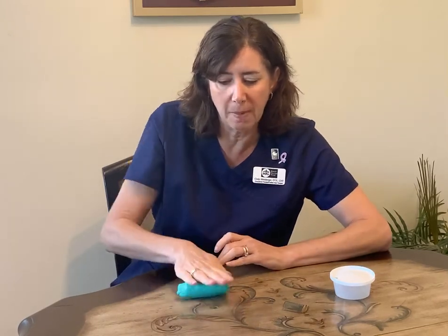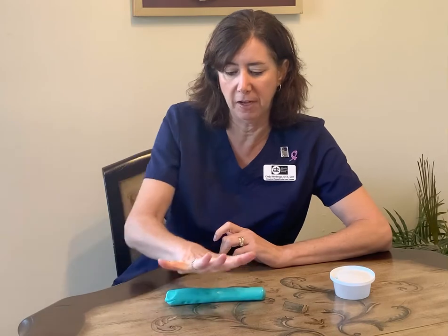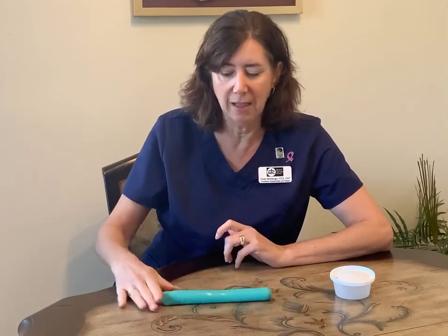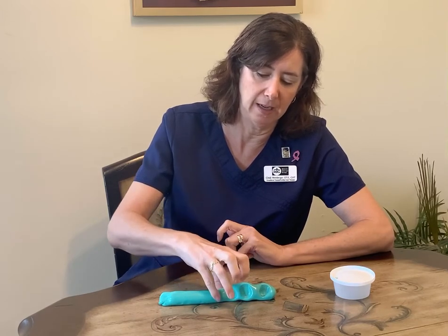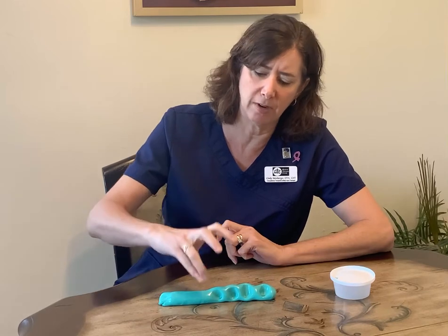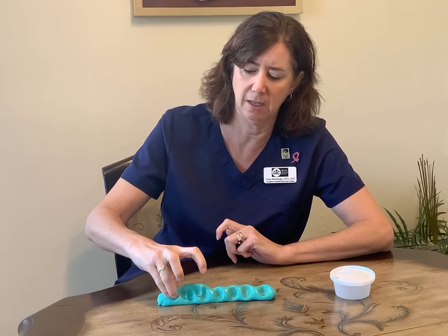So you roll the putty out into a log, again using the affected hand. Keep your fingers nice and straight when you roll. And then once you get a log, you're going to pinch alternating fingers. So index, middle, ring, and pinky. If you find it's too difficult for the pinky or the ring, do those two together. Sometimes that makes it a little bit easier.